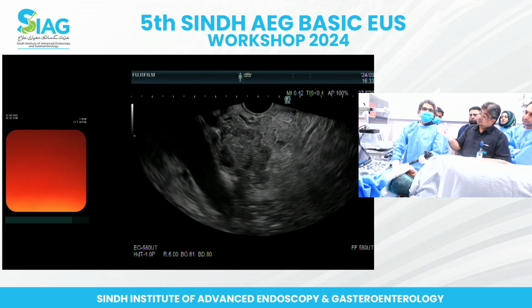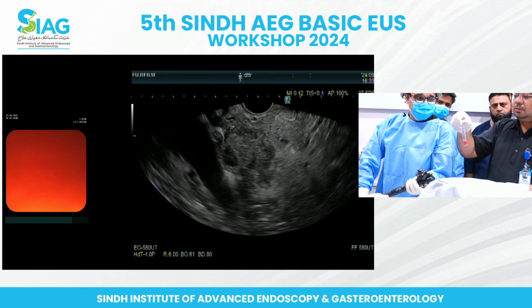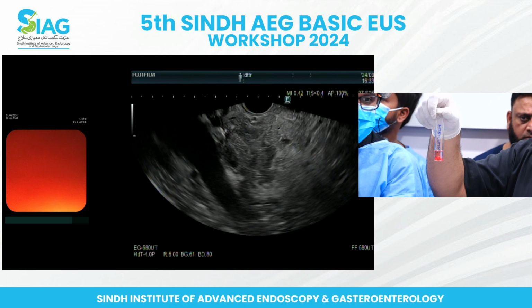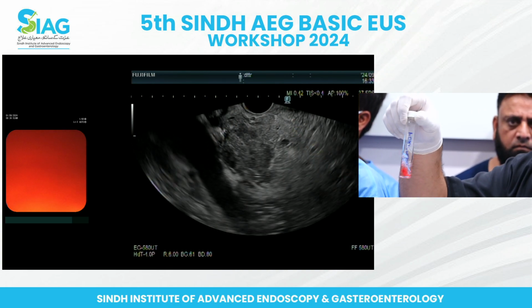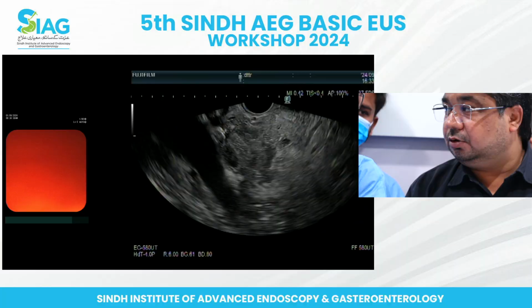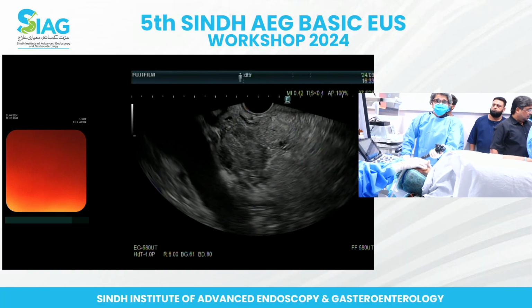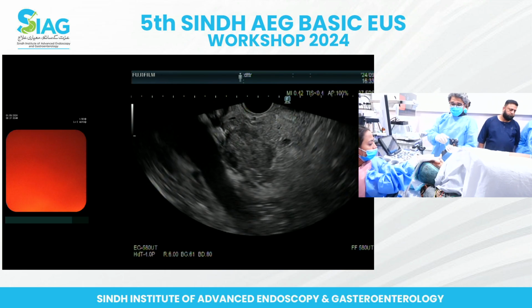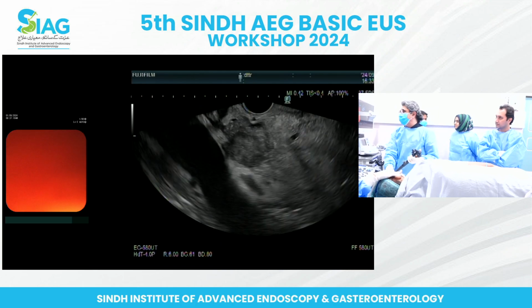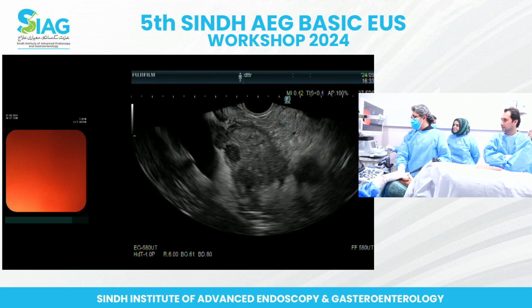Oh, it looks gorgeous. It looks gorgeous. Oh, there's lots of white tissue there, we can see it from a distance. Fine, yeah, okay, good. So that's a good sample, well done Farooq. Did everybody appreciate the white tissue? Okay. I think I'm happy if anyone in the audience wants us to go again. I don't think there's any need, but I'm happy to go back if anyone in the panel feels we should.